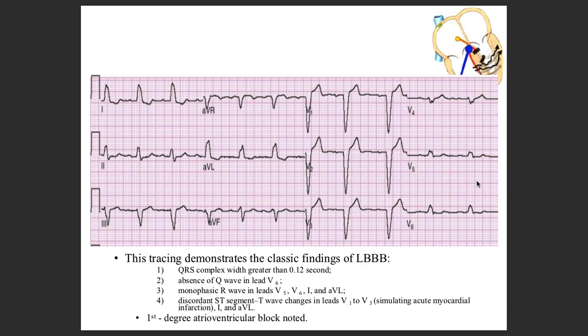So what is Q wave indicative of? The start of ventricular depolarization. Q wave, I'm asking. Okay, you're almost there in that direction. But what is the definition of a pathological Q wave?